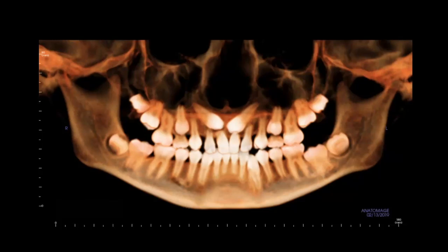Okay, you could wear elastics or TADs. Let's go with elastics first. So if you wore elastics, where would you wear them? Okay. Okay, so yeah, just kind of like some sort of a triangle over here on either side. Kind of keep a little bit more anterior. Try to bring those in that way.